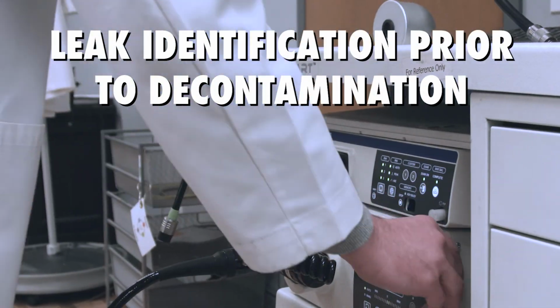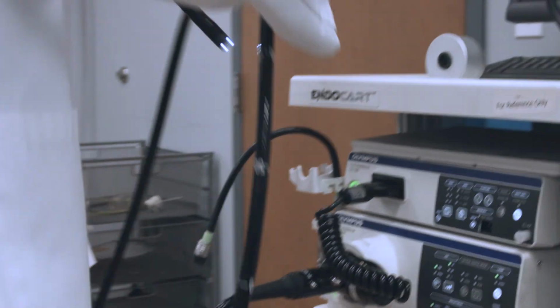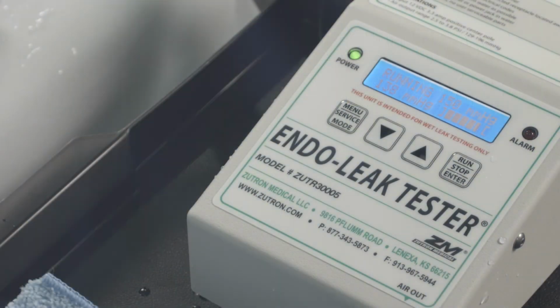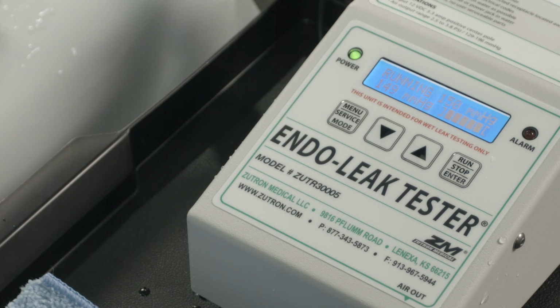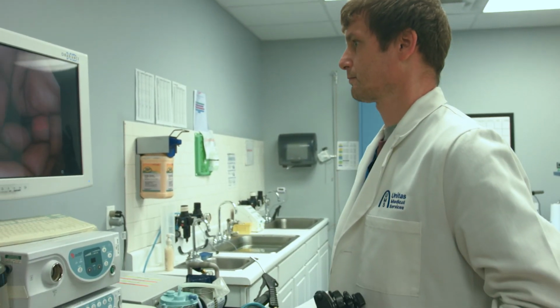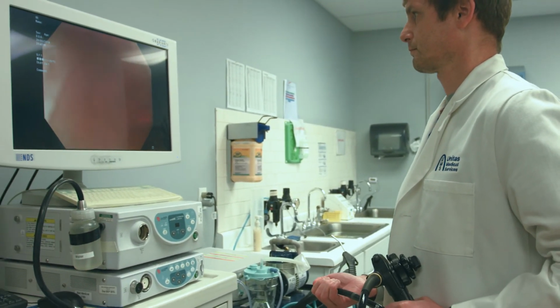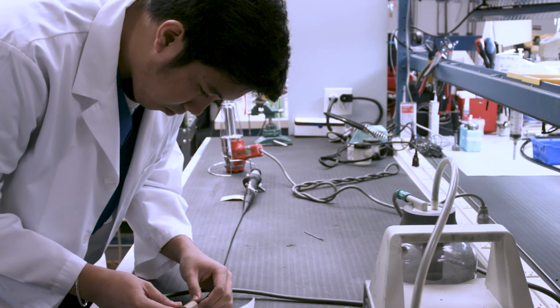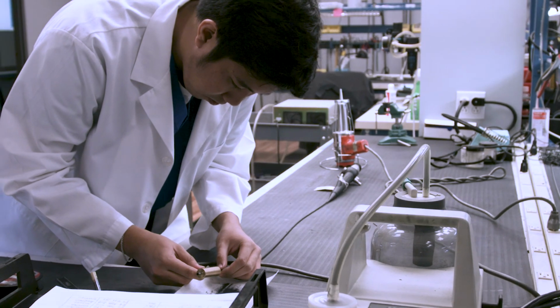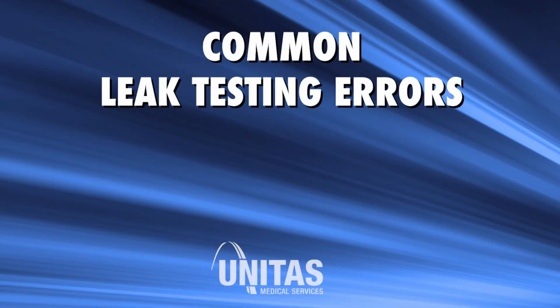Secondly, leak identification prior to the decontamination process will alert the cleaning technician to take special precautions during the rest of the cleaning process. Air pressure will need to be maintained through all subsequent cleaning steps, as if it were a long leak test. This will protect the endoscope from additional fluid damage. Third, effective leak testing will lower the severity and the number of fluid invasions and, thus, reduce the cost of repair. Common leak testing errors.